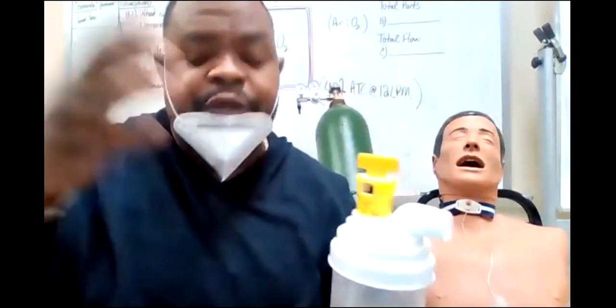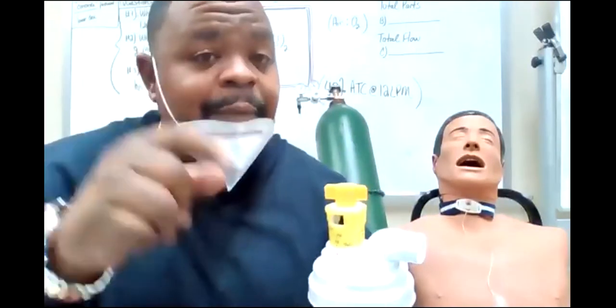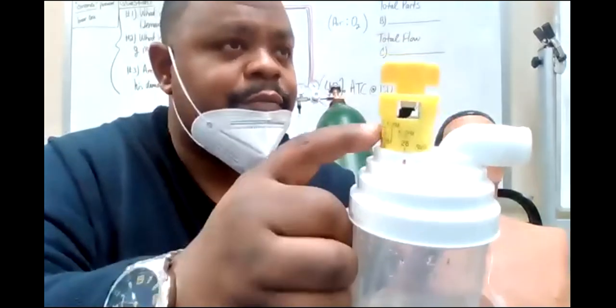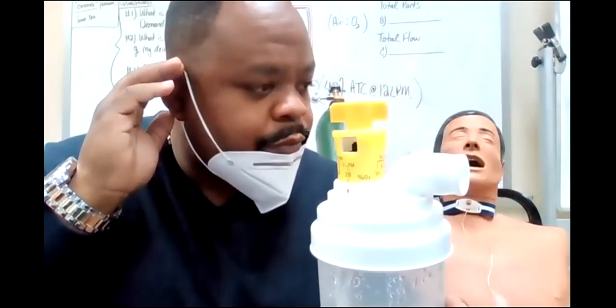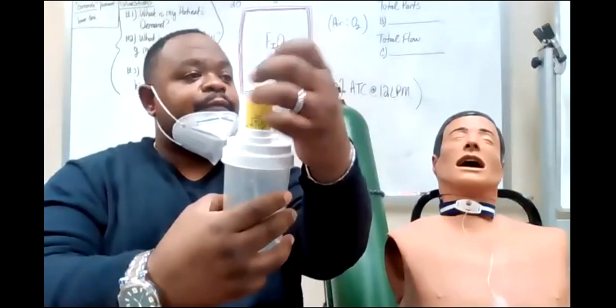Quick question. I've seen nurses flabbergasted trying to figure out what the FiO2 is. One time a nurse had this hooked up to the air flow meter, okay? If this is hooked up to the room air flow meter, the yellow Thorpe tube, does any of this matter? No, sir. Doesn't matter, because if they're on an air flow meter, they're only getting what? 21%. Good.